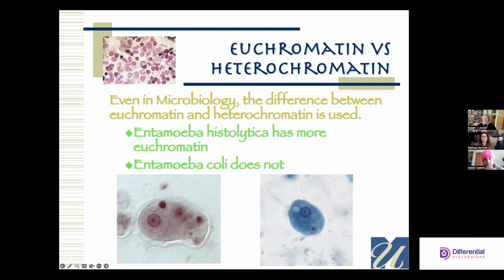What do I need for a nucleus? I need one that's active. I need one that's busy. I need one that's functional. I need one that doesn't have much heterochromatin. I have an even, thin nuclear membrane here. Yeah, occasionally you can have one dot, but most of the time there's this thin-walled, smooth chromatin nucleus.